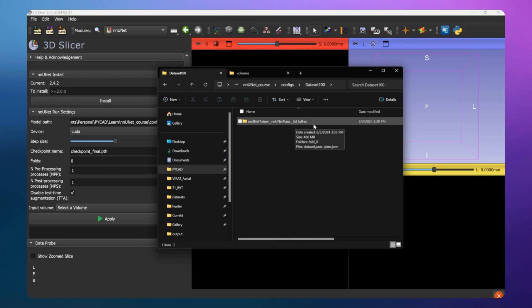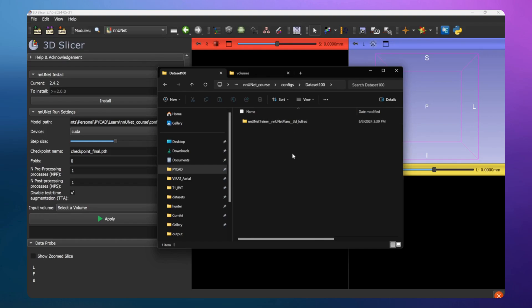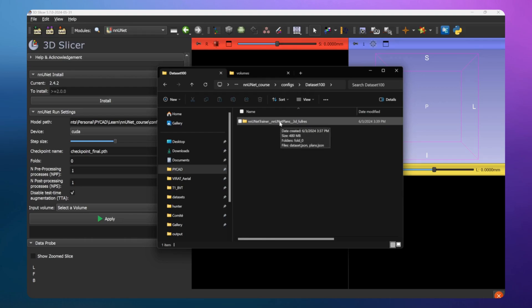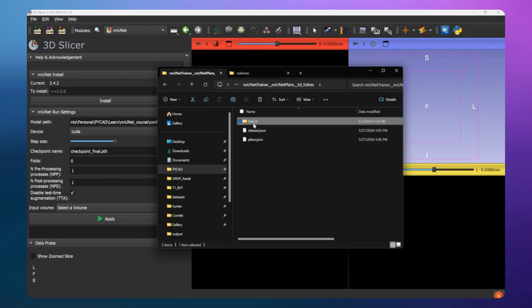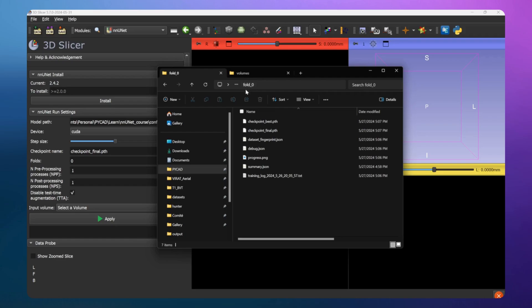Inside that folder you should find the NNUnet trainer and NNUnet plans subfolders, and for example '3d_fullres'. The naming must match what NNUnet uses - 3d_fullres, 2d_fullres, etc. Inside you should have the plans.json and dataset.json files, then fold subfolders named fold_0, fold_1, fold_2, etc. These fold names are used by the extension to locate your weights.